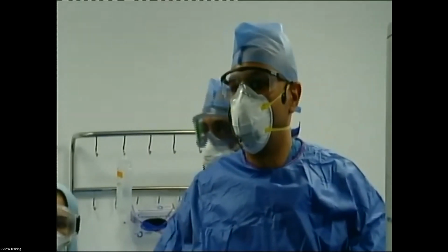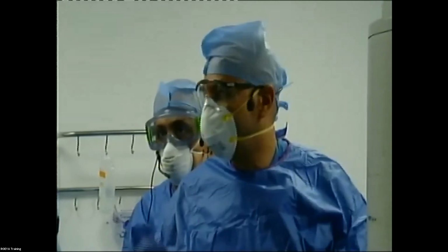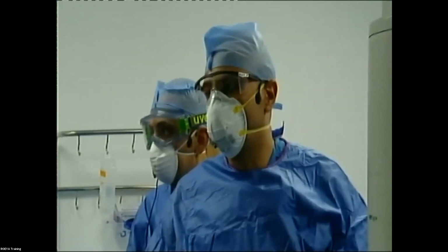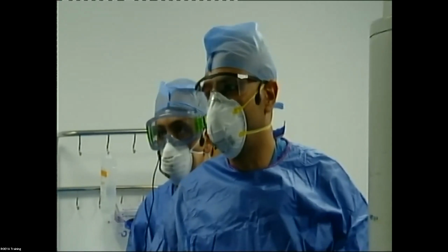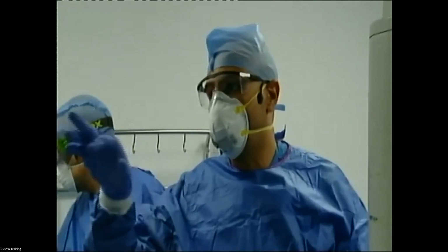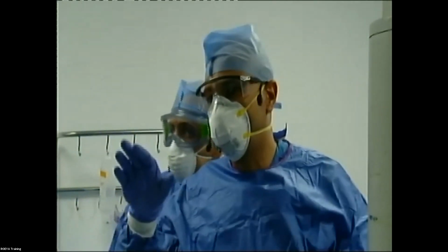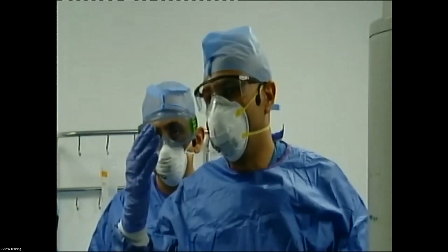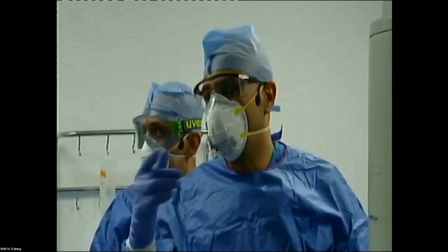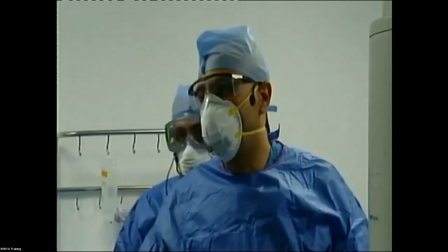Okay, so now you have the image of the fluoroscopy. This is from the last case. I wanted to show you the double guide wire technique that I used for cannulation. As you can see, we have the guide wire. It entered several times, so I just leave it there, and over it you go outside, get another sphincterotome or a catheter, and use the guide wire to direct it in the direction of the bile duct.